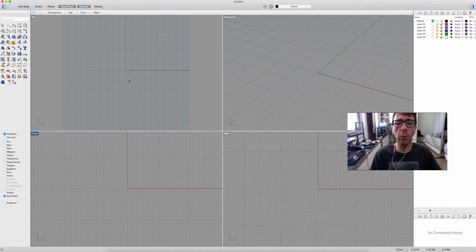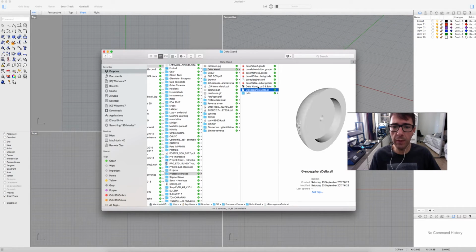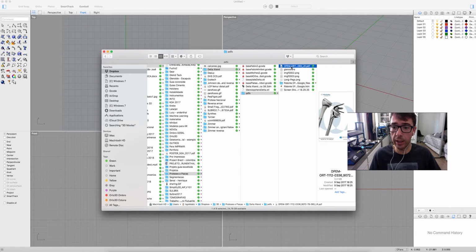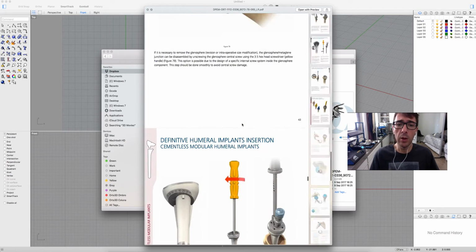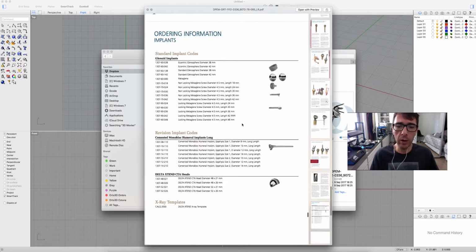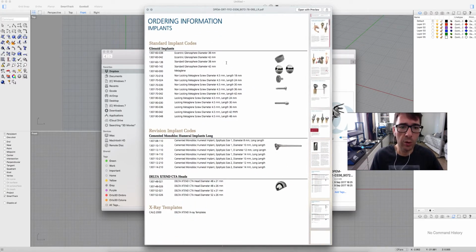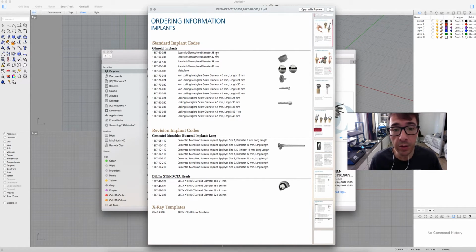But first of all, we need to take measurements. So we have opened here the glenosphere, the DePuy Synthes. This is just an example. So we must take some measurements, okay? So we know here they have shown us that we have a 38 millimeter glenosphere and a 42 millimeter glenosphere. We're going to create a 38 millimeter glenosphere.